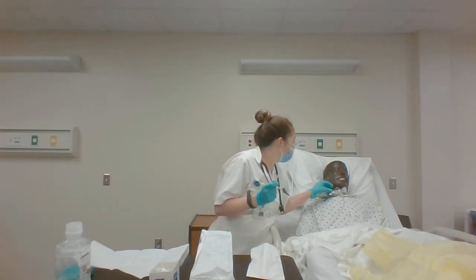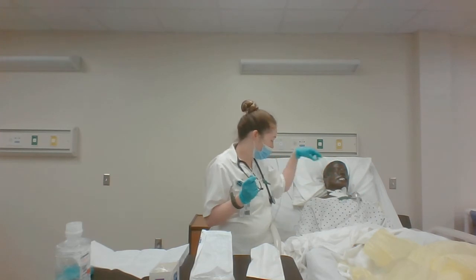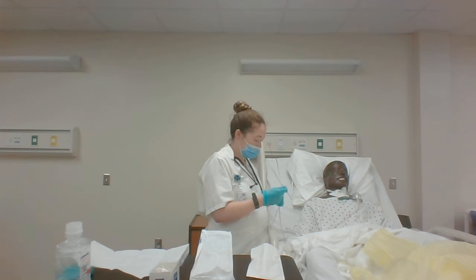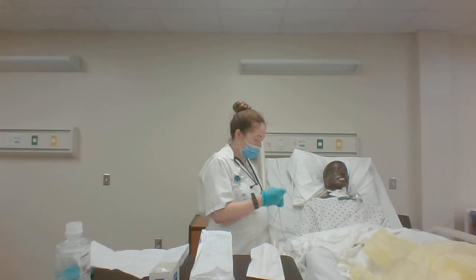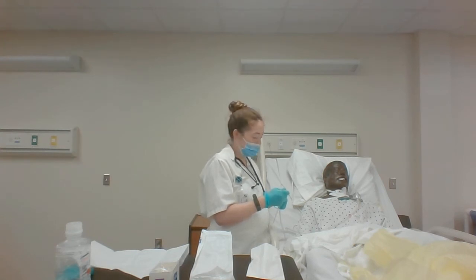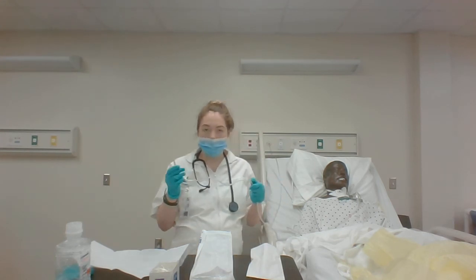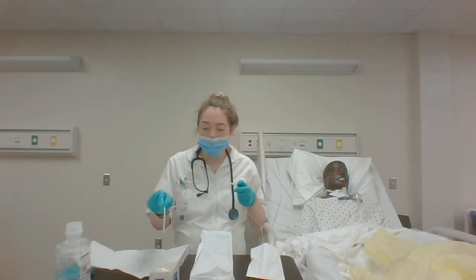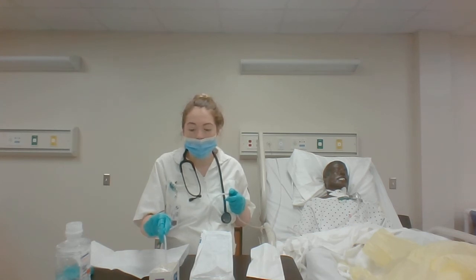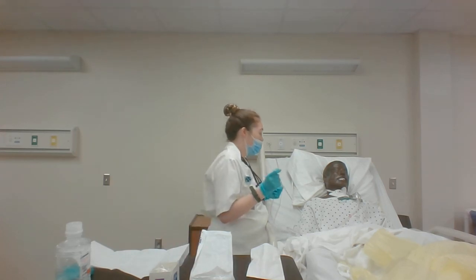I'm going to remove the oxygen source with my non-dominant hand and then attach the catheter, also with my non-dominant hand, making sure not to touch the connector with my sterile hand. Once attached, I'm going to check the patency in my sterile saline with my suction catheter — it is patent.